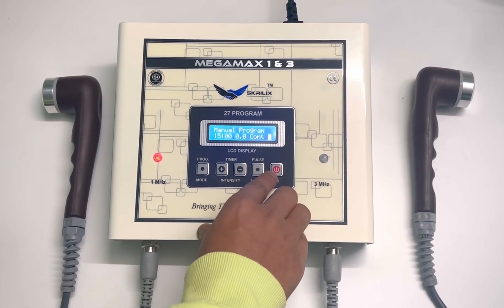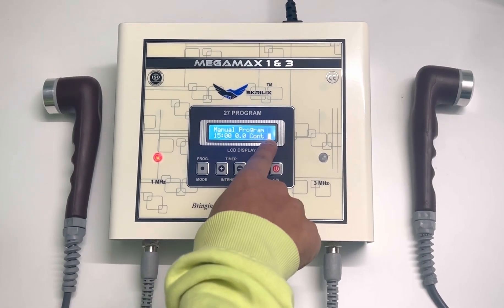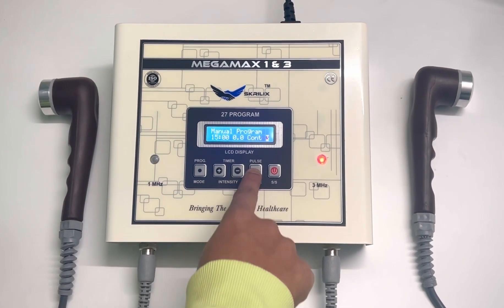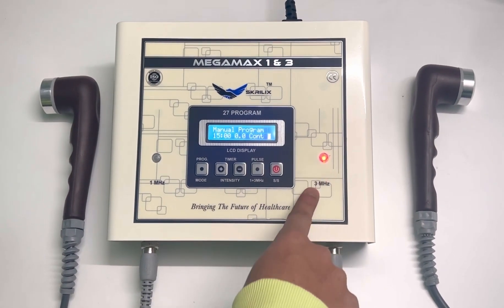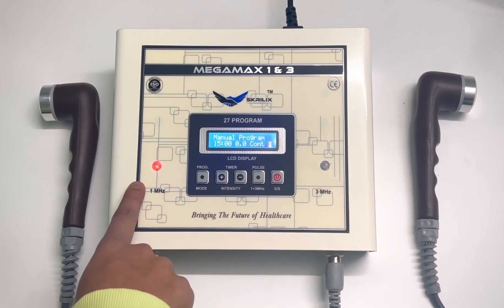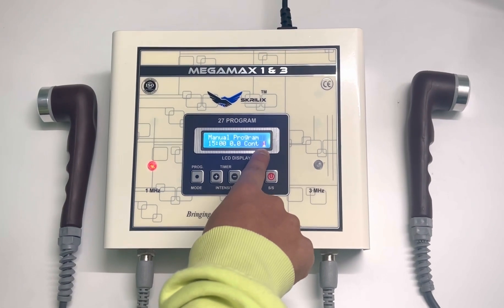If you click on this, the 1 MHz indicator will start blinking. If you want to use it on 3 MHz, you have to press this button in this area when the machine is in this area. When you press this part, the 3 MHz starts blinking. If you press it again, 1 MHz starts blinking.